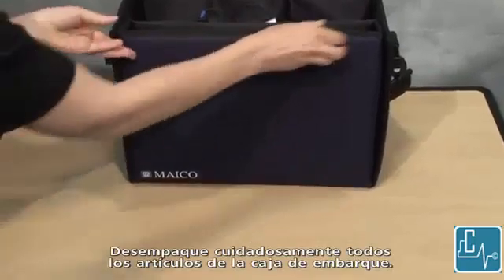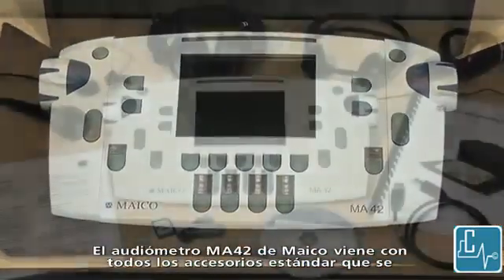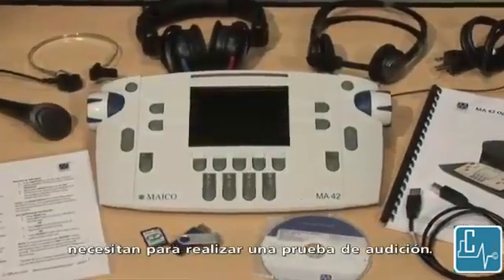Carefully unpack all items from the shipping box. The Maico MA42 audiometer comes with all the standard accessories necessary to conduct a hearing test.